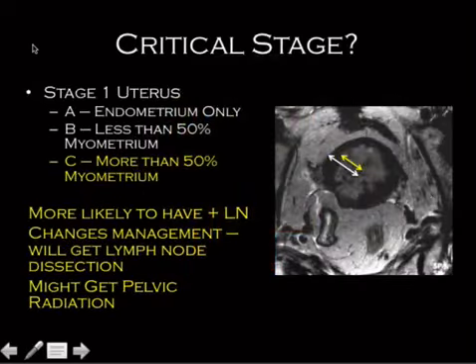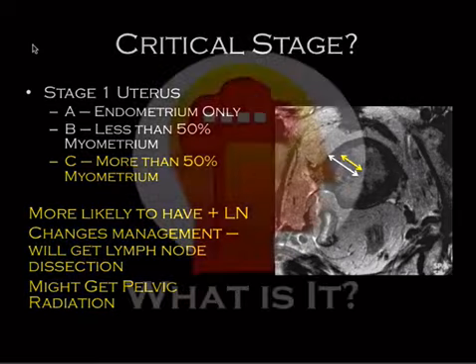So MRI has kind of a limited role with regard to endometrial cancer workup, and this is one of the roles, is to look to see how thick it is. So like, why would you do it? That would be the answer of why you might do it.